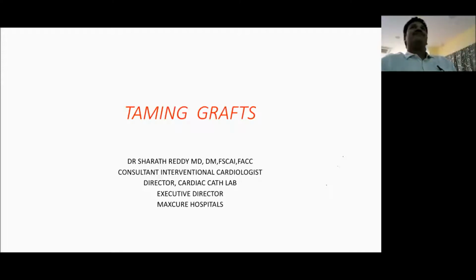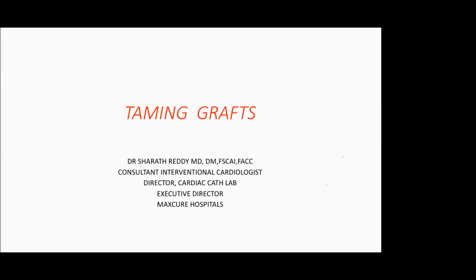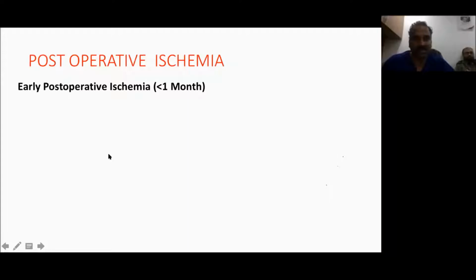Okay, today's topic is basically taming grafts. It's basically understanding the anatomy and so making your cannulation capability more effective. That is the goal of today's presentation. So why do we have to do a graft angiogram? It is basically post-operative ischemia.